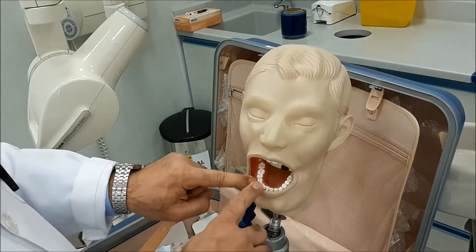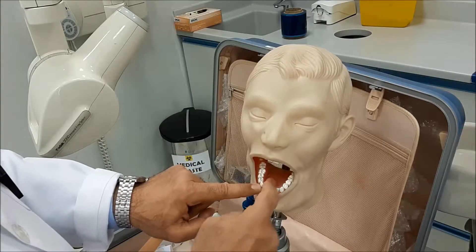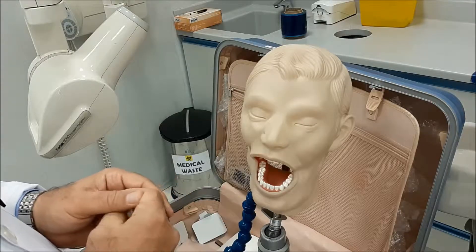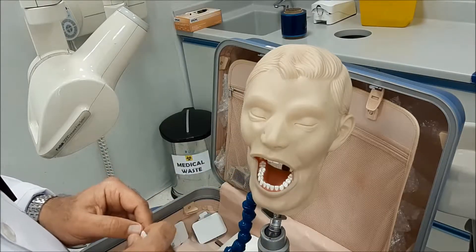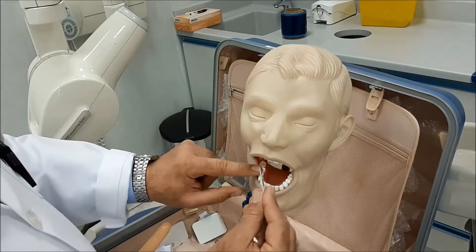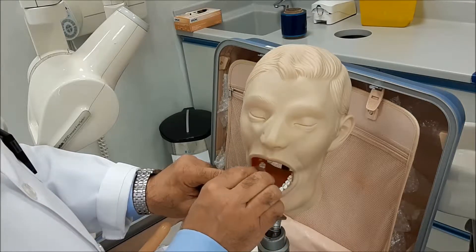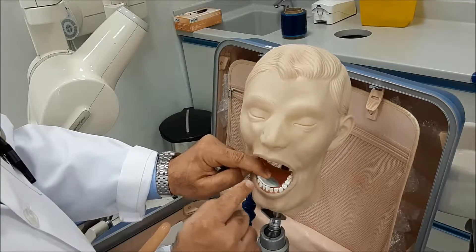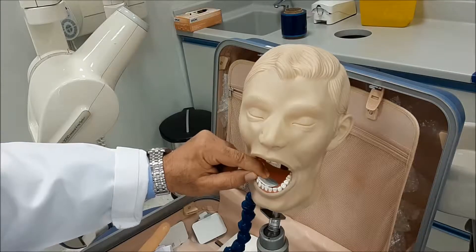Our target tooth is the canine, so you expose or reflect the lip so that you can see your tooth, and you look inside so that you would see the anatomical areas related to this tooth. Then your sensor will be — exposure side held in this direction. You reflect the lip and hold it this way, and just follow the tooth exactly so that the canine will be in the exact center of the sensor.